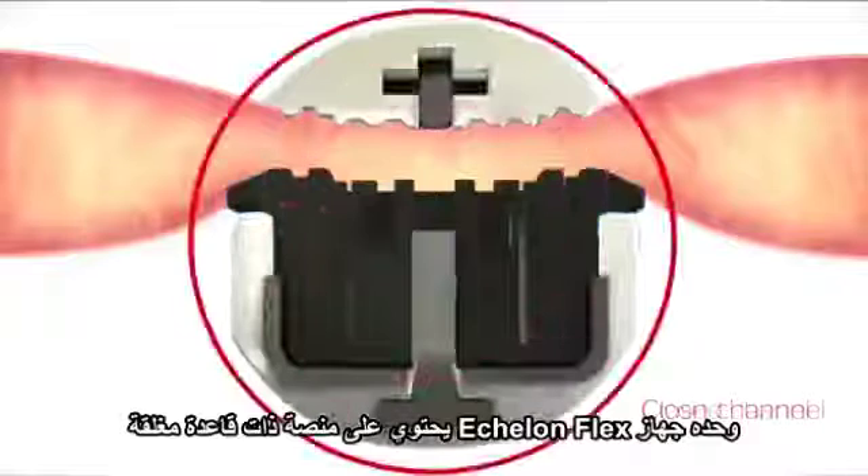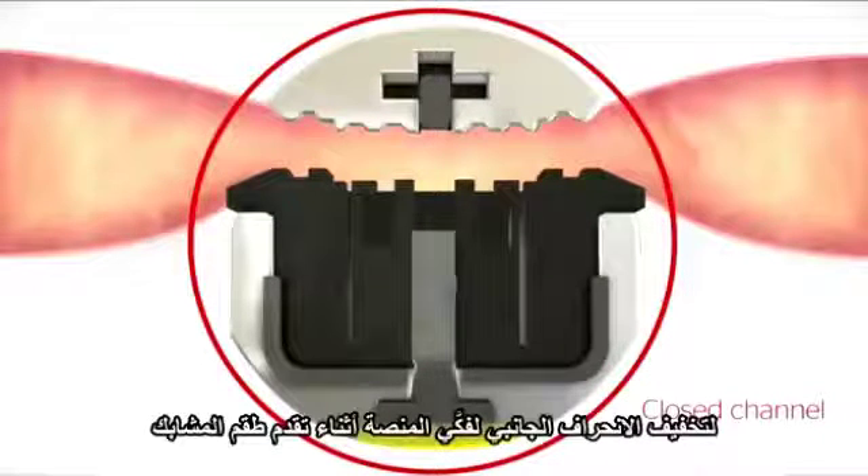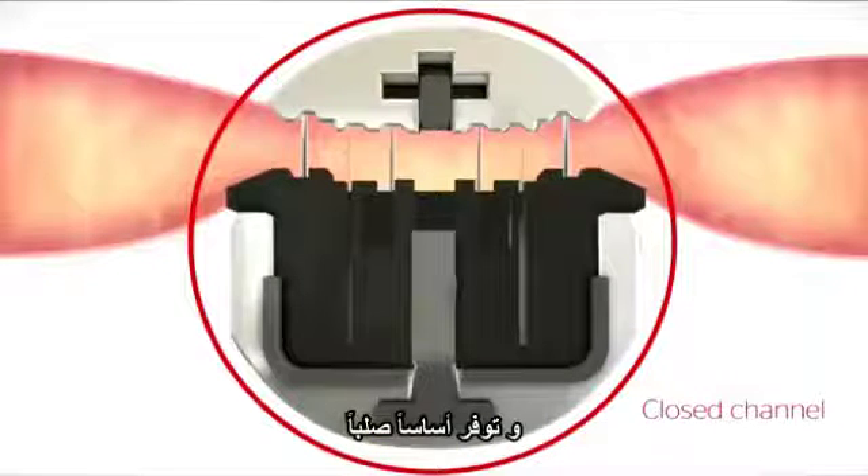Only the Echelon Flex Powered Plus stapler has a closed bottom channel to reduce lateral jaw deflection during E-beam advancement and provide the most rigid foundation.